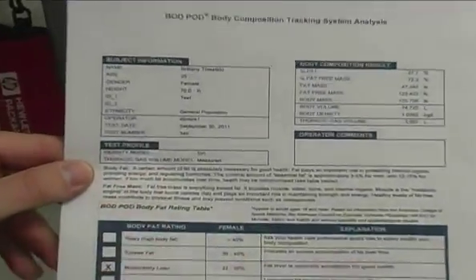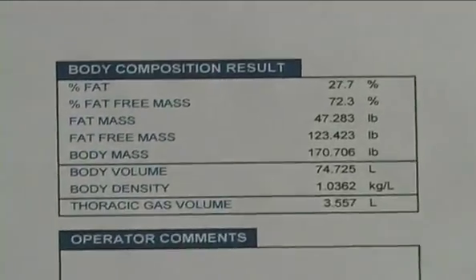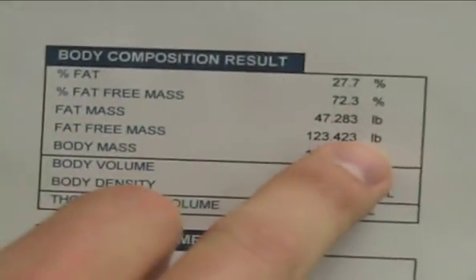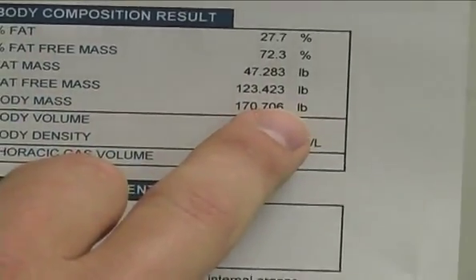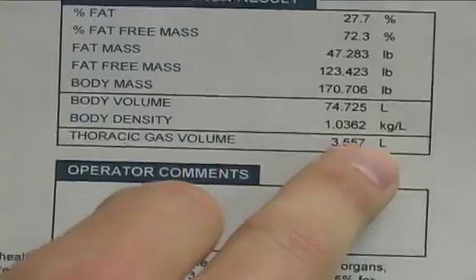So here's what the printout looks like. We have Brittany's demographic information that Stacy entered. We have the density model, and that we did a measured thoracic gas volume. Here are the results. So it's broken down into two compartments similar to hydrostatic weighing. So you have the percentage of fat-free mass or lean mass, and then it breaks it up according to pounds of fat mass and fat-free mass, and the total weight, the body volume as measured in the BOD POD, her density, and then her thoracic gas volume measurement.